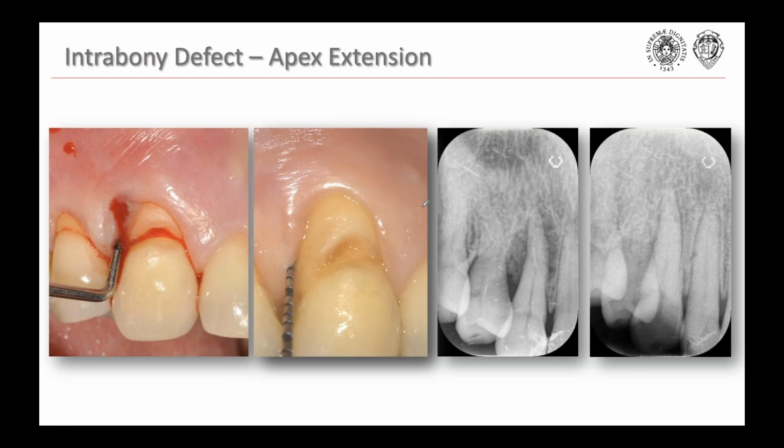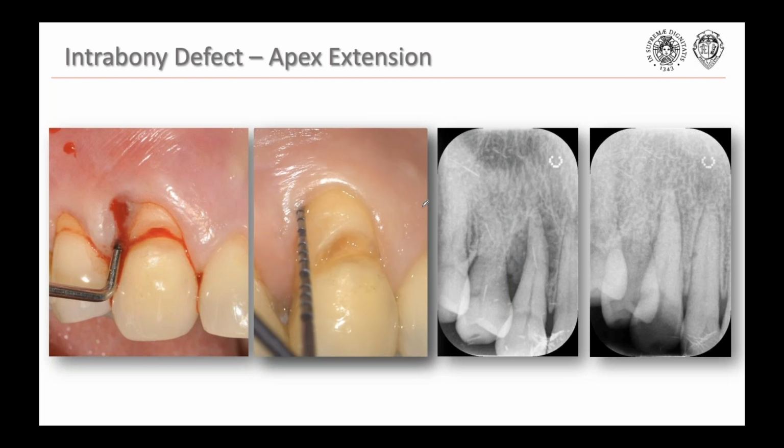This is absolutely important. Always remember, the x-rays is for the show. What is important is that when you press, the probe doesn't go through. That's when you know that things are done.